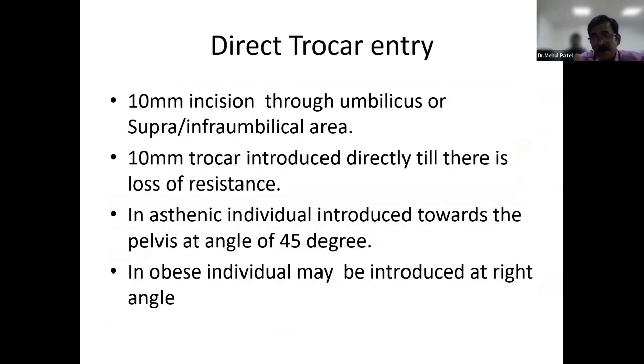This is practiced by a lot of surgeons. People who are conversant claim that they can do a safe entry by using a direct trocar. But as a beginner, one should not attempt this technique, because a Veress needle injury will be a very small point injury, but if you make an injury with a direct trocar entry, it will be a massive injury and you might land up with a lot of problems. But again, this is a described and established technique of creating pneumoperitoneum.